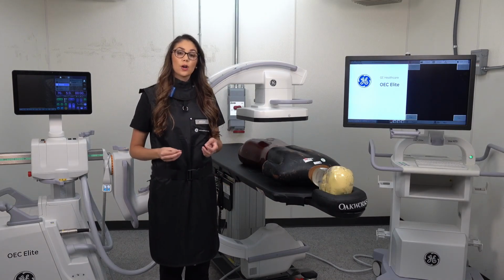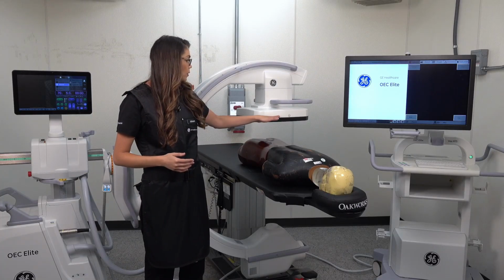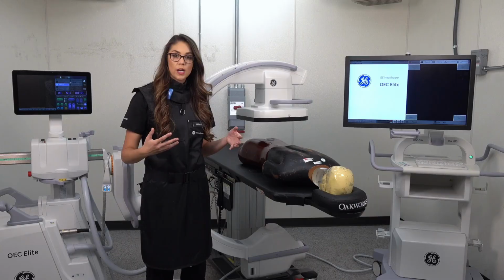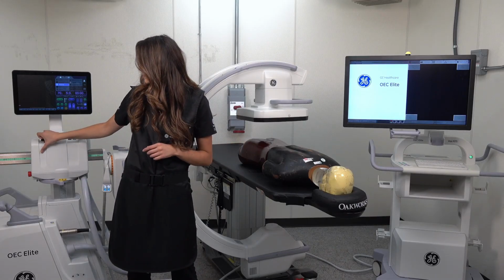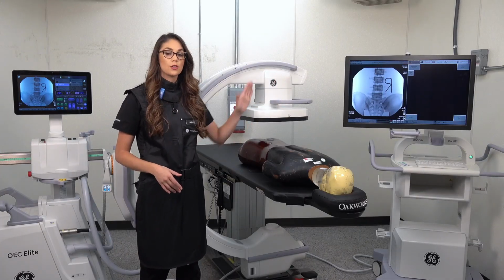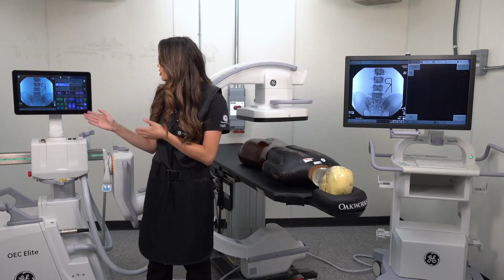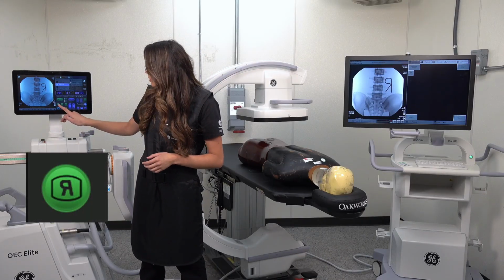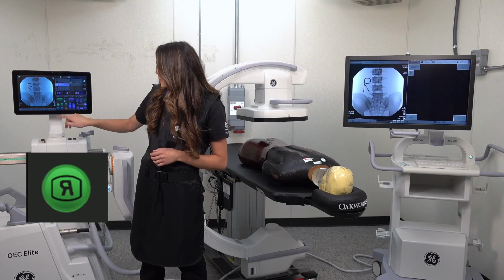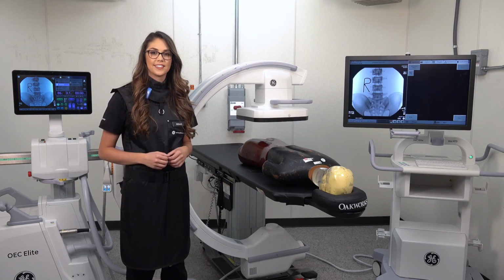For this case, our patient is positioned prone. Because of that, we will need to orient our image, and I have a marker to help illustrate that. So when I take my first picture, you will notice that the image needs to be flipped so that the right and left are displaying anatomically correct. On our touch control panel, you will notice that there is an R that is backwards. Once you select that icon, it will then anatomically orient your image.